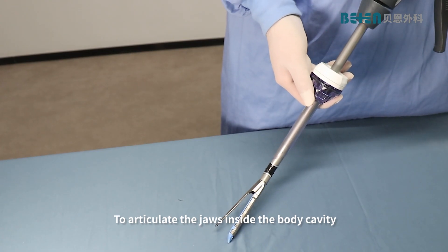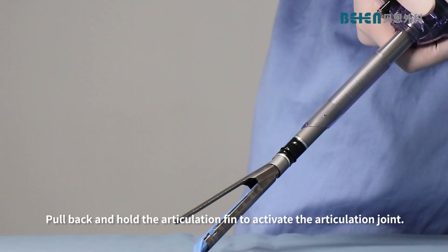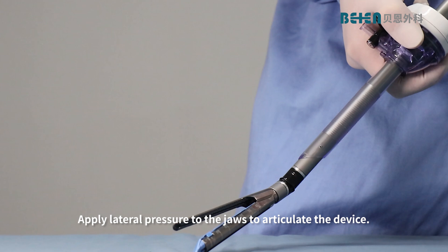To articulate the jaws inside the body cavity, ensure that the jaws are in the open position. Pull back and hold the articulation fin to activate the articulation joint. Apply lateral pressure to the jaws to articulate the device. Release the articulation fin to lock the jaws into the articulated position.